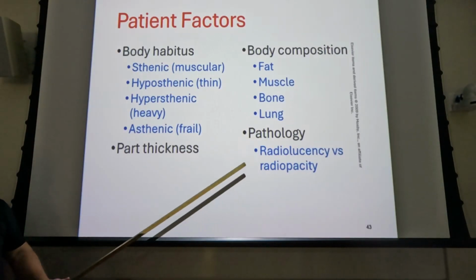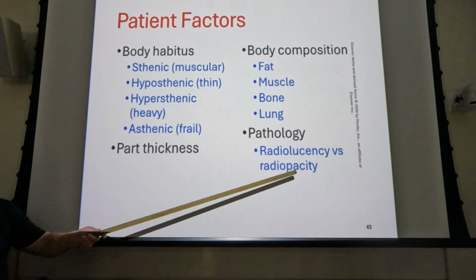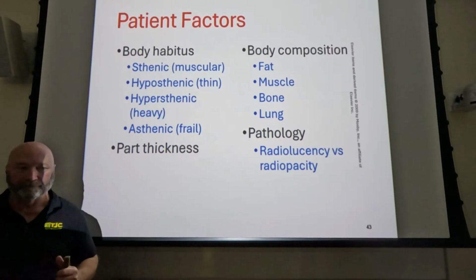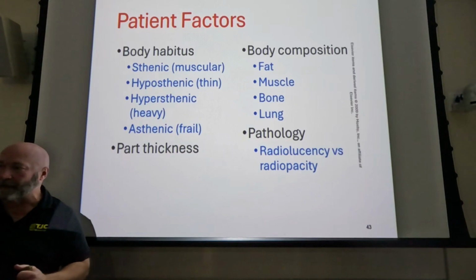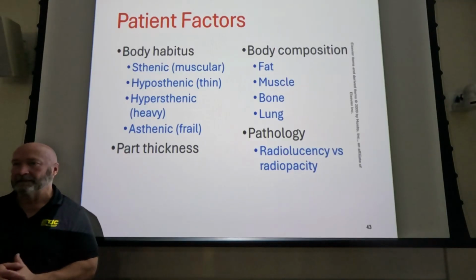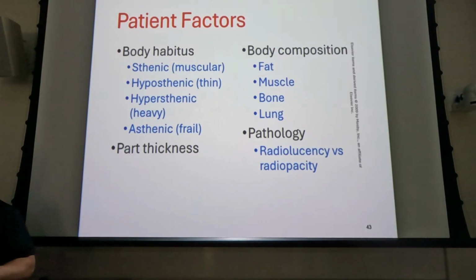Okay, so then pathology, and we just kind of touched on that. We've got two different types of pathology. One's additive and one's subtractive. So additive pathologies are pathologies that would add patient density, osteopetrosis. Destructive pathologies would be any kind of pathology that removes. So you got osteoporosis.